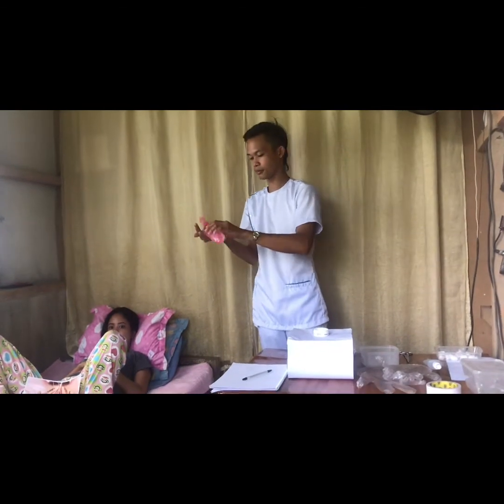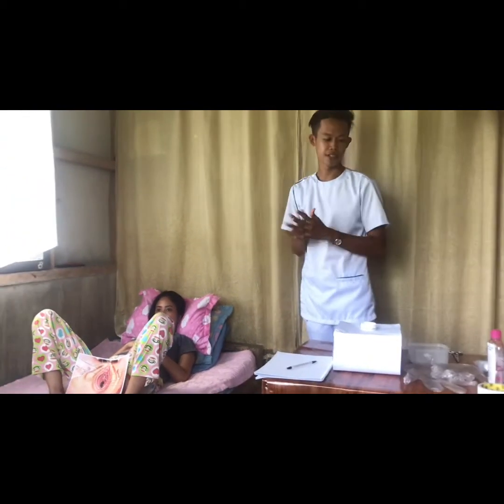So as you can see, the private part of the patient is now exposed. So the next thing that we're going to do is to perform hand sanitation. I already have good lighting. At the same time, privacy for the patient is now secured. So for this time, I am done with the hand sanitation.